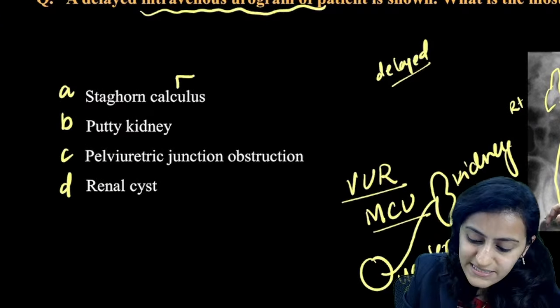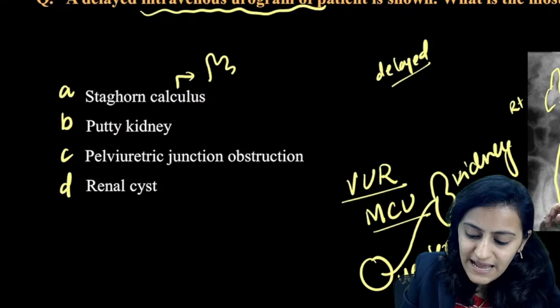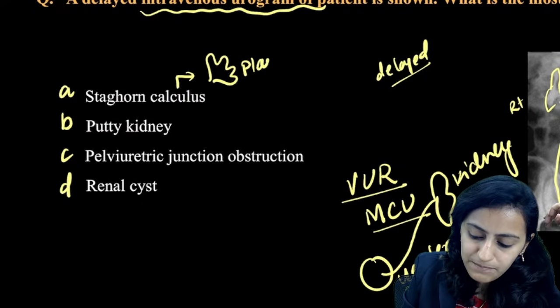Why is this not Staghorn calculus? Staghorn calculus you would see on a plain radiograph itself.